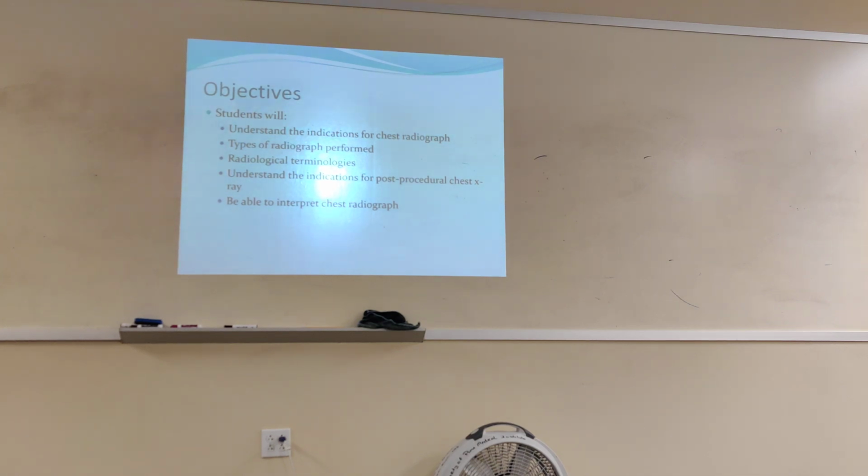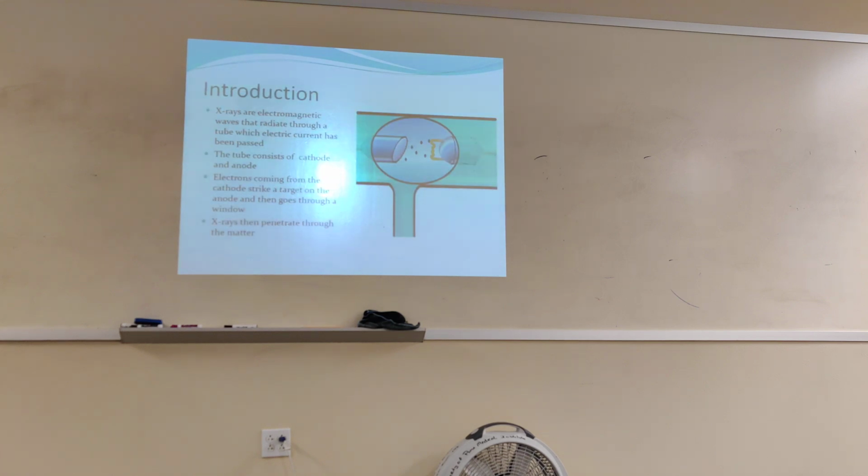So this is how X-ray is produced, not very important. There are electromagnetic waves that go through a tube that electrical current has been passed through. So no big deal.